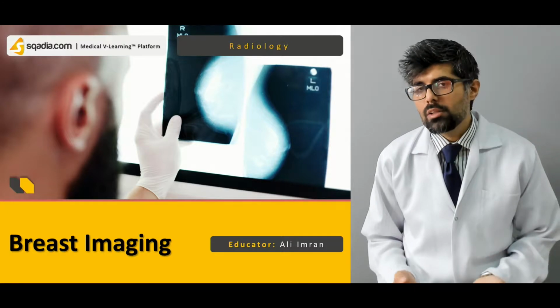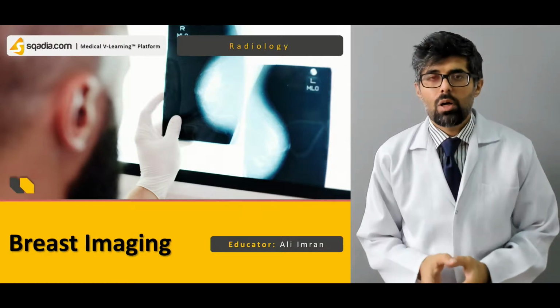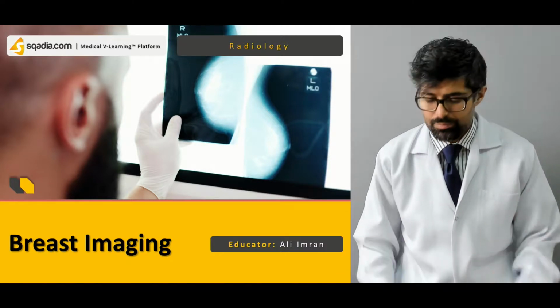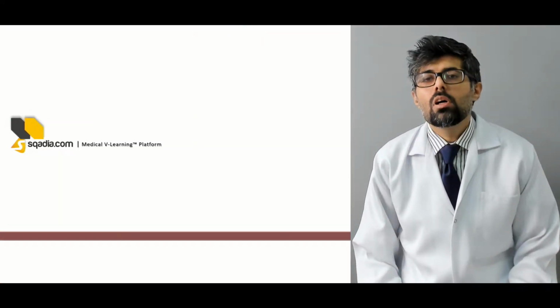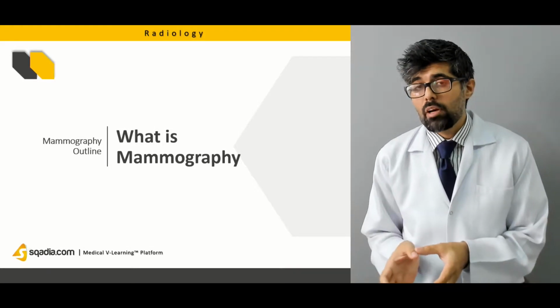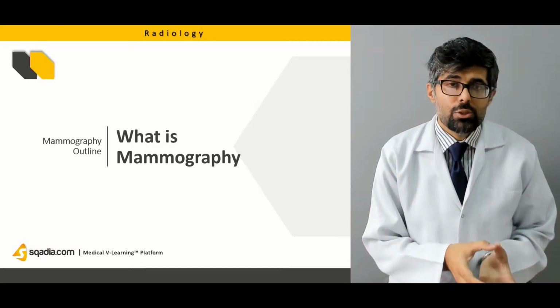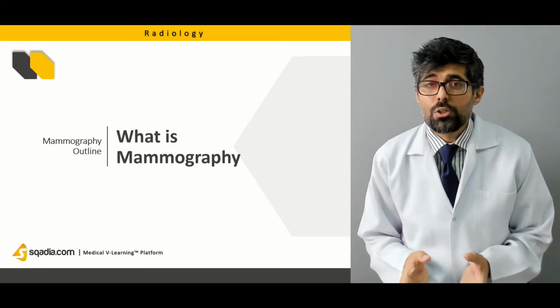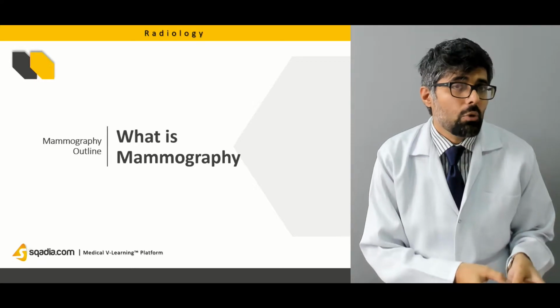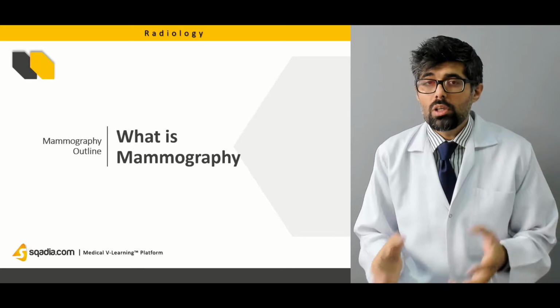I'm your educator Dr. Ali Imran and today's lecture is about breast imaging. So in this lecture we will learn about mammography. What is mammography? How is it done, what kind of x-rays are used, what kind of projections are used, what is a screening mammogram or what is a diagnostic one. We'll learn about it all in this lecture.